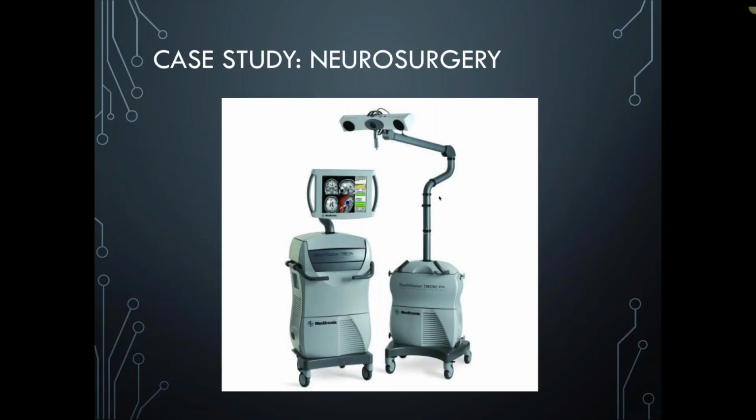Eventually, as the cases get processed through our system, the maps we generate of those functional areas are sent to the surgical navigation system, which is shown here, and then that's registered to the images and co-registered stereotactically with the patient during surgery, so the surgeon can see precisely, in registration, where they're actually resecting the tumor, exactly where the functional areas are.